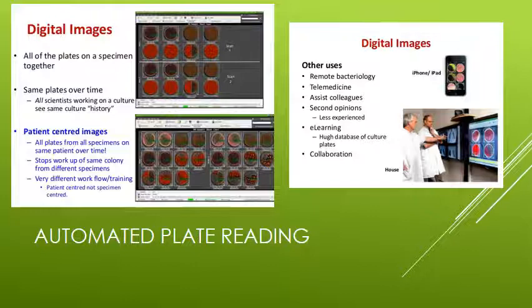If you look up here, you can see the plates for that particular incubation, right? Scan 1, what grew? Scan 2, what grew? Okay, day 1, here's what grew. Day 2, here's what grew. You set all of these parameters. How long am I going to keep these? These look more like throats or urines or something like that. I can't really see the chocolate. This looks like a urine plate. I'm not sure. But anyway, it'll keep a record of this, and it'll keep that record with the patient file.